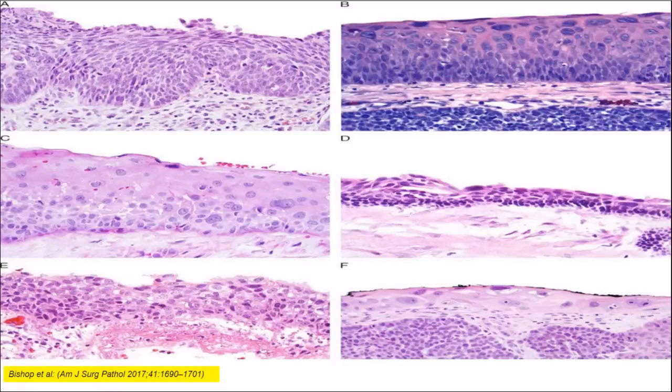And then one of the interesting things that they also noted in their paper, like we saw in ours, is that there was some sort of surface involvement in a high proportion of cases. And so some were clearly CIS or high-grade dysplasia, but some just basically had some cytologic atypia in the squamous epithelium. But that could be a marker for you as you're looking for these lesions, is seeing if there's overlying squamous epithelium with some atypia when you're dealing with this undifferentiated tumor in the submucosa.